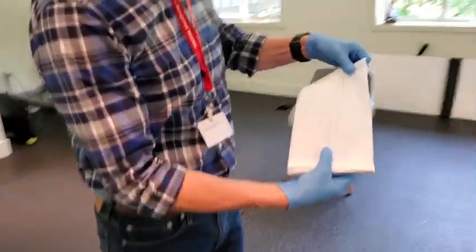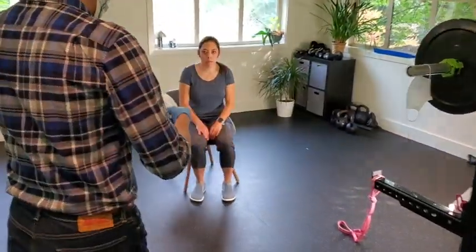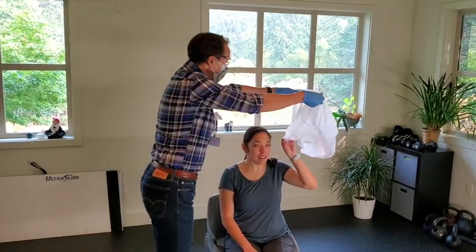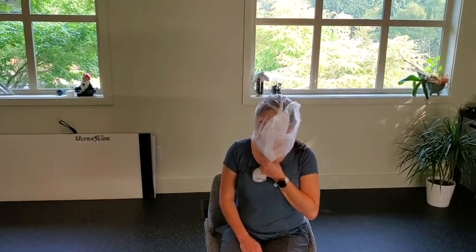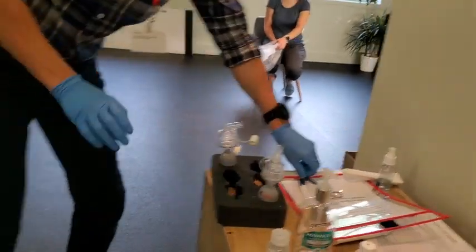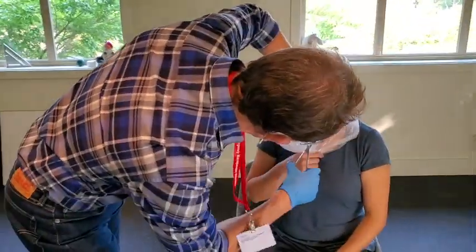Have a seat. What is this? Oh, plastic bag. All right. First thing, am I meant to talk through this? You can. Okay. First thing we're going to do is test your sensitivity to the solution. Unfortunately, that means putting a plastic bag on here, mainly because it's disposable. So if you can just hold it loosely there, and then I have to grab scissors. I can't see what's coming out. Sorry, as you suffocate over here. So loosely hold it.